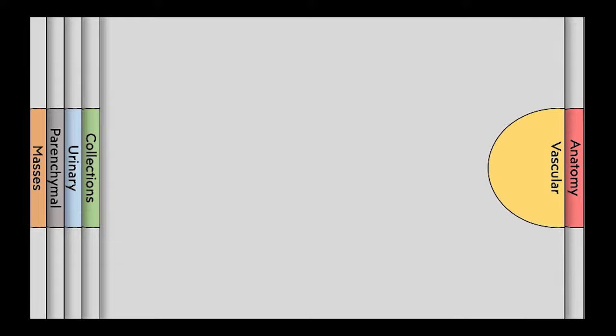Now moving on to the vascular section, which is the largest and, in my opinion, the most important topic of kidney transplantation. This is where the radiological interpretation is very much needed in transplant management.